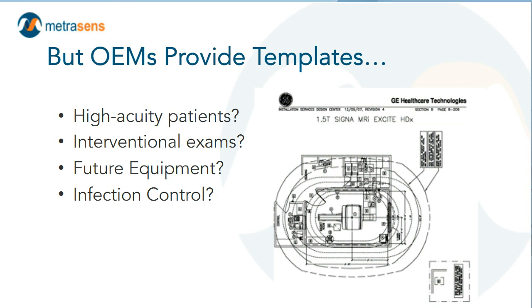COVID, for God's sakes, we're going through one of the biggest infection control tests of healthcare facilities. And quite honestly, a lot of radiology has been failing the test. We have not been as diligent about infection control, infection prevention in radiology spaces as perhaps we ought. So these are some of the ways that our prototype template designs really don't get down to the nuts and bolts of what we need from MRI facilities.